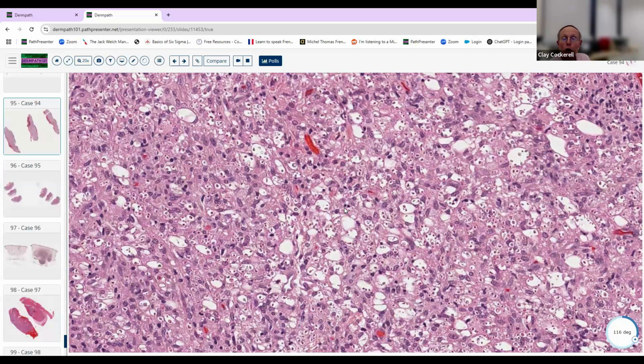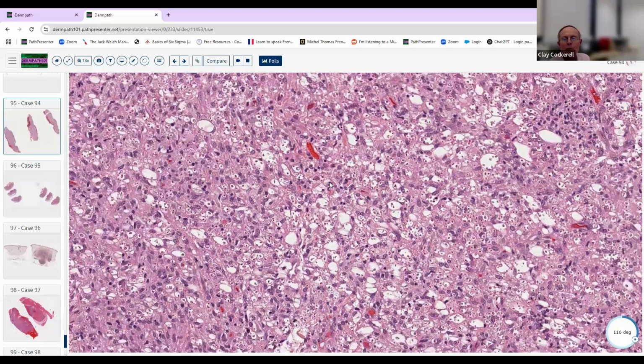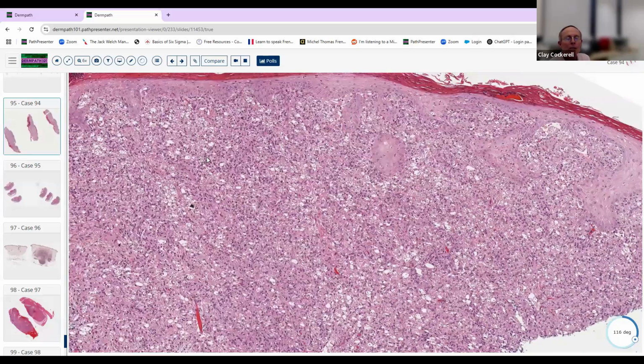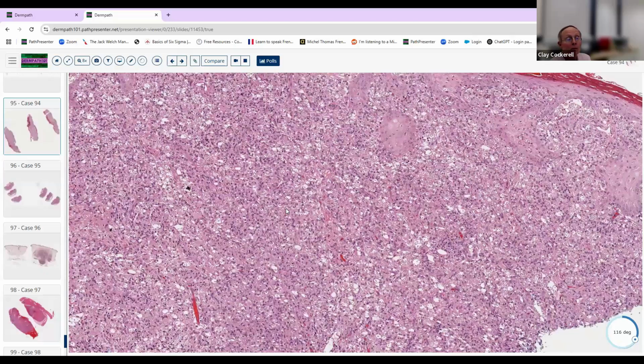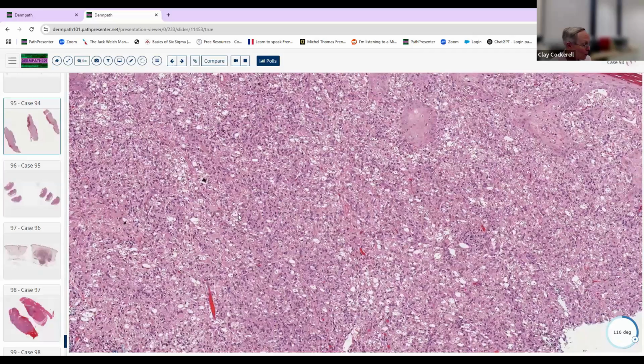This is classic for crypto. The rhinosporidium in there, those are way larger, giant organisms here, not these tiny little cells with these capsules surrounding them. Nothing listed here looks like crypto in this list of choices. Lobo doesn't give you these large, clear staining gelatinous capsules like you see with crypto. Cryptococcosis. Sometimes the capsule is so prominent, you see mostly capsule and just a really few number of organisms. So that's crypto.